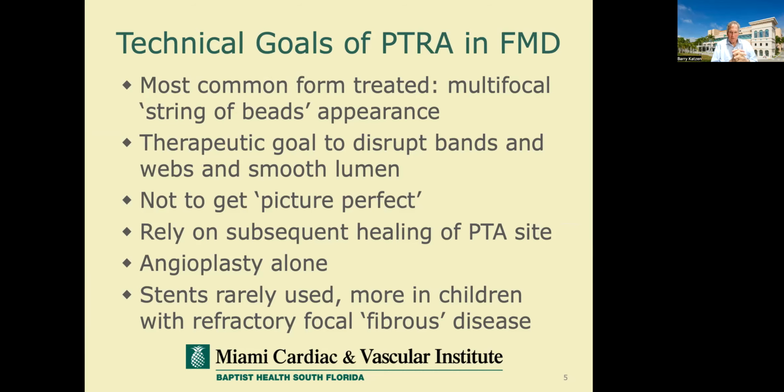Most common form that we treat is called multifocal, with the string of beads appearance. The therapeutic goal is to disrupt these bands and webs and create a smooth lumen. But in reality, we learned early on that getting a perfect-looking picture is really not the objective. It's better to rely on subsequent healing of the angioplasty site, which occurs over time. So we're not looking for a perfectly smooth appearance. We're generally not going to see that at all in the FMD lesions.